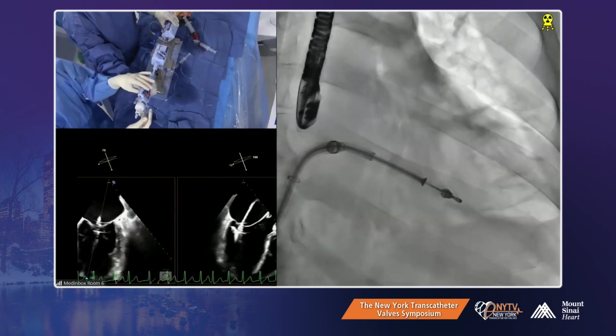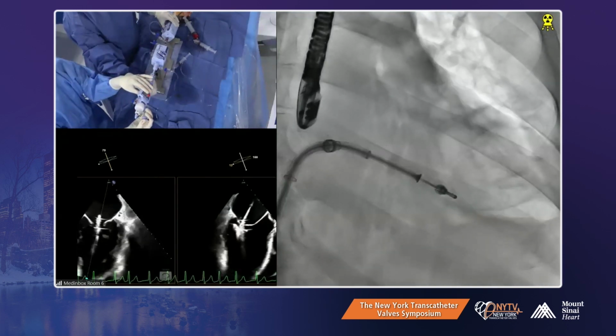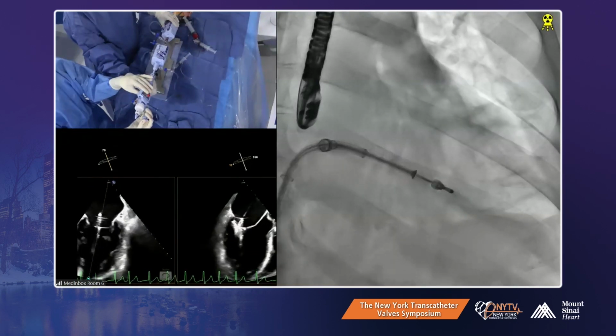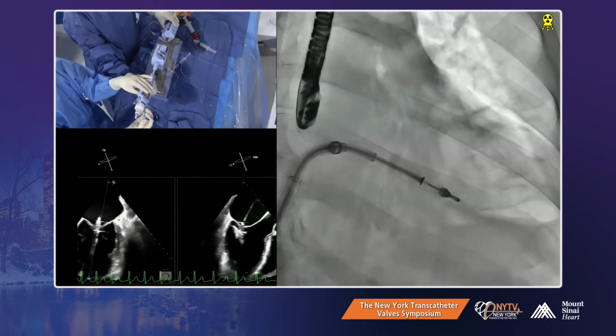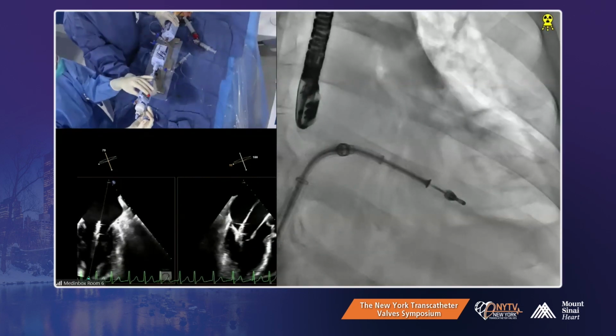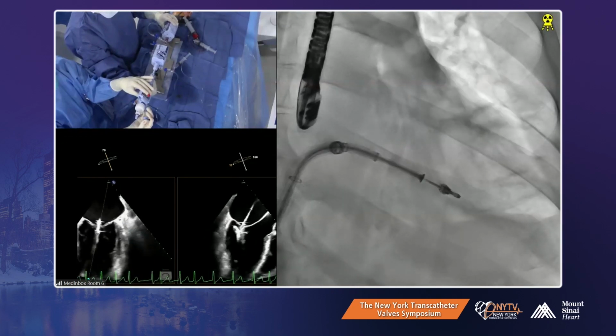That's where the wide clip doesn't help, actually, especially if you think you're going to need two. I'm more of a fan of NTW in these tented valves because I think you put a lot of stress on the valve when you grasp it. One thing you can do is not close it all the way after you get both leaflets. A little anterior. Don't pull up yet.